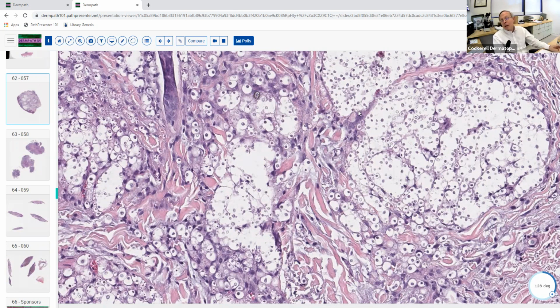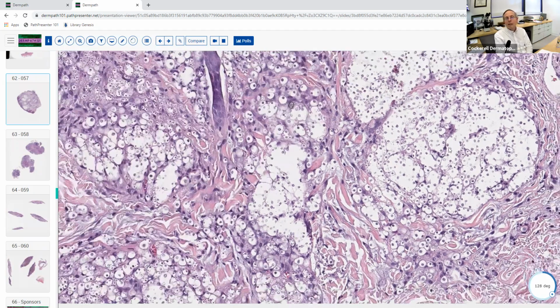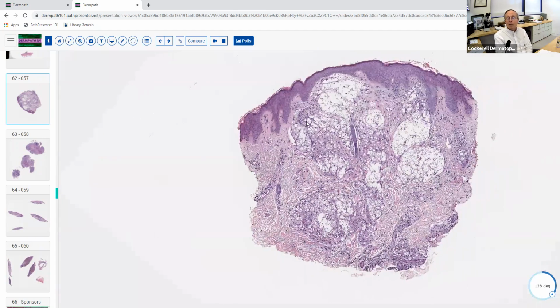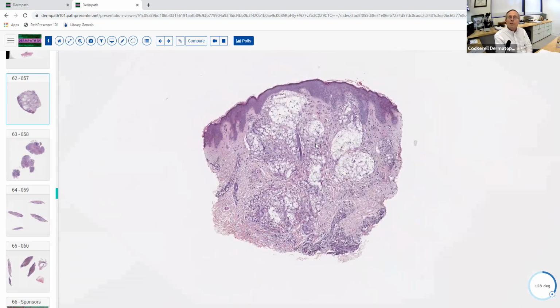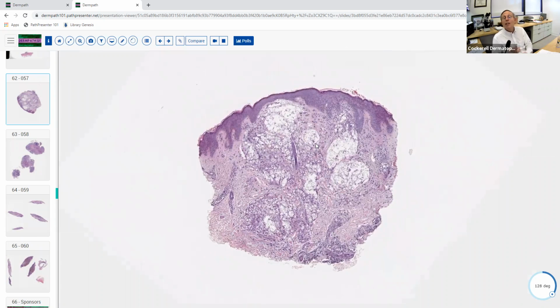And it's obviously not paracoccidioidomycosis. That didn't give you a capsule either. So this is a beautiful example of cryptococcosis. And you know, what they could ask is something like that, expect you to know this. This gentleman presented with multiple lesions, or which kind of clinical scenario is commonly associated with this entity? Widespread umbilicated papule simulating molluscum contagiosum.